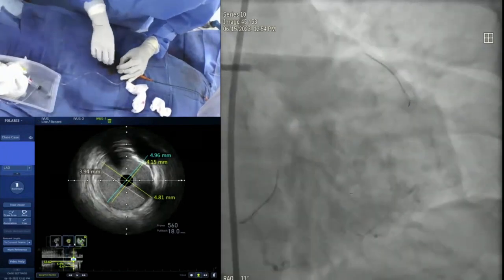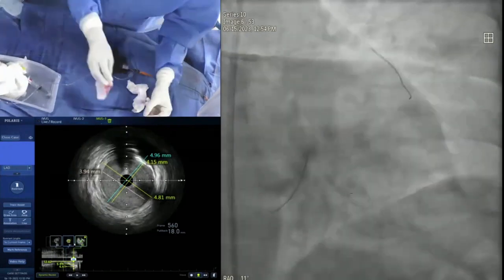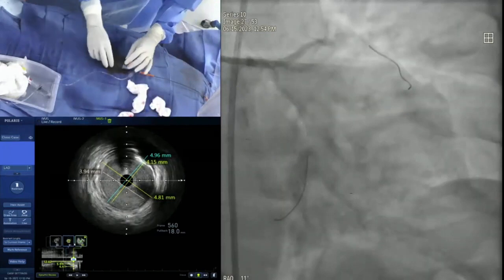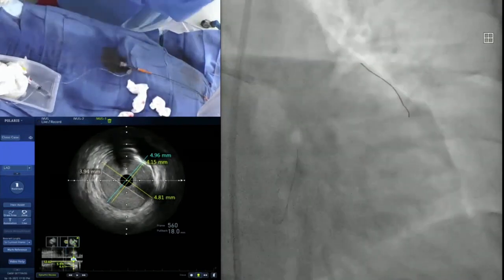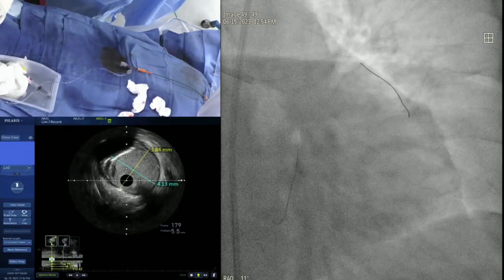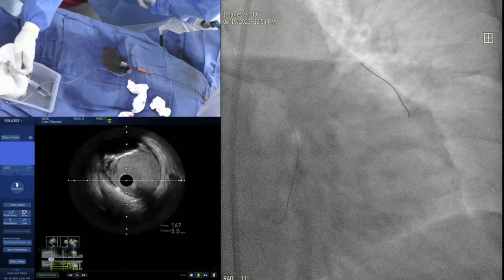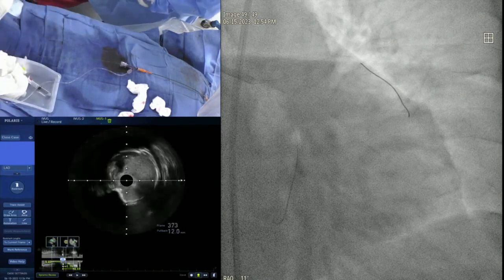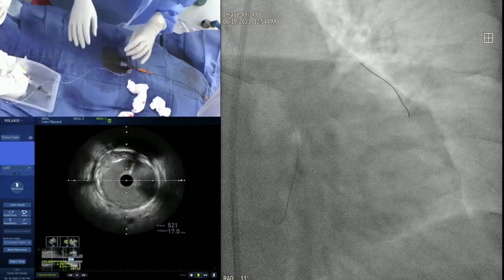It seems to me that the majority on this panel would like you to just take a longer stent and go just across that LAD, but you're not going to do that. Then let's see. Give me the diameter of the LAD. Yeah, the average EEL is 4.0. 4.0. No, but you don't need a 4.0 or 18. Yeah, so we can go 18. Okay. And then get a 4.5 or 8 millimeter balloon ready.